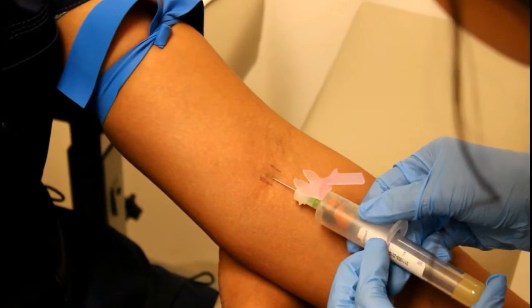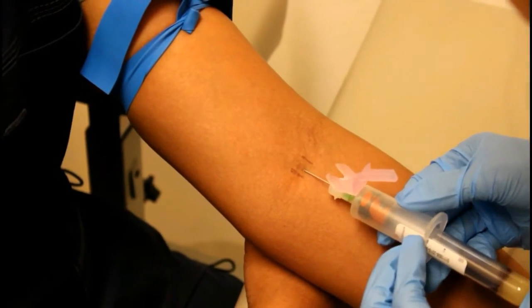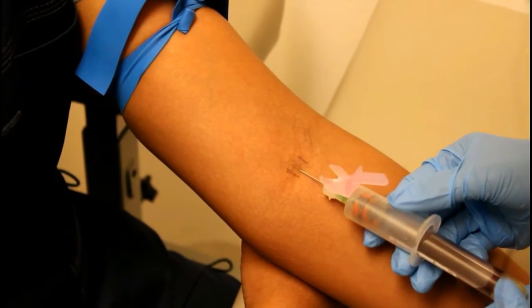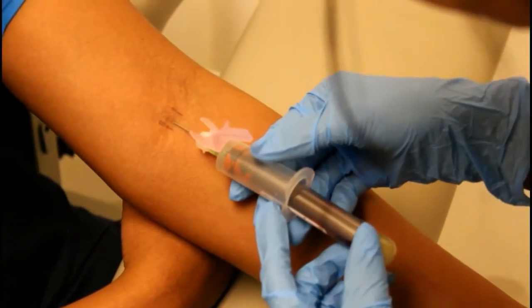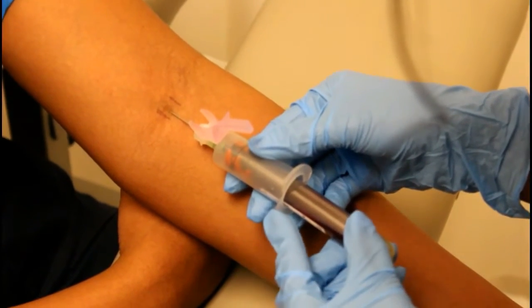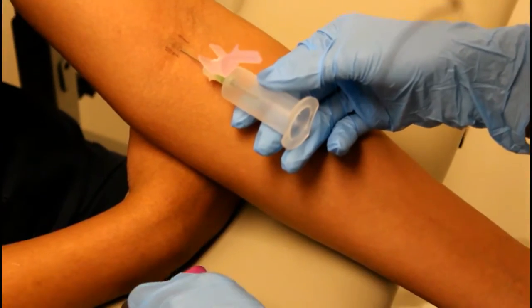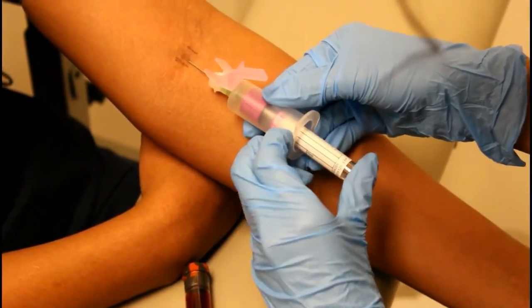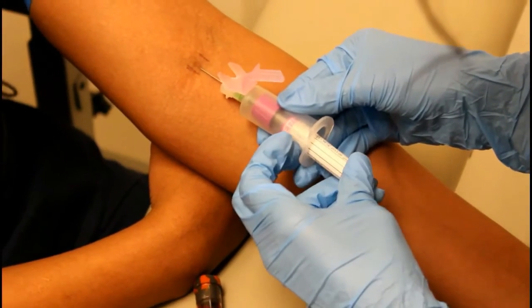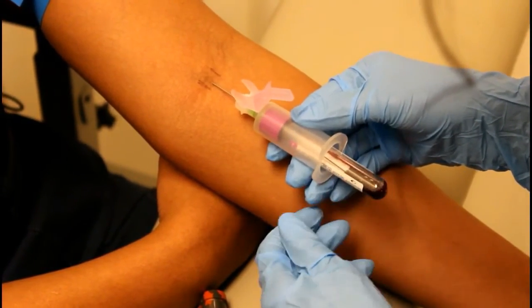With the vacutainer ready in the hub, push in to collect your sample. You'd want to try and fill 3/4 of the tube. Then steadily remove the tube, not the needle, and place the next tube. When switching tubes without causing the patient discomfort, you want to steady your hand against the arm. Then you can pop the next tube in without pushing the needle any deeper.